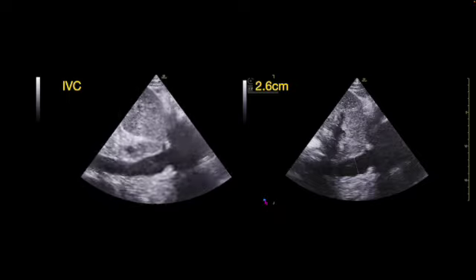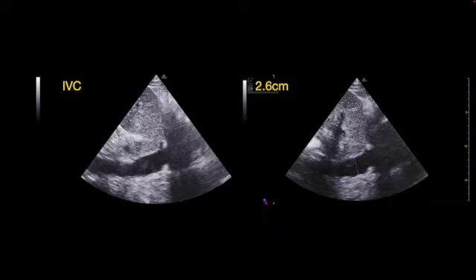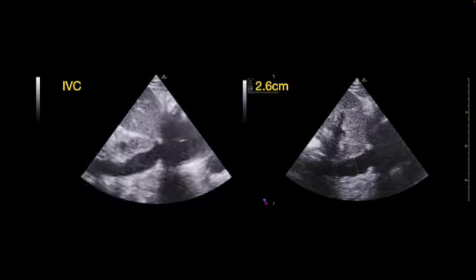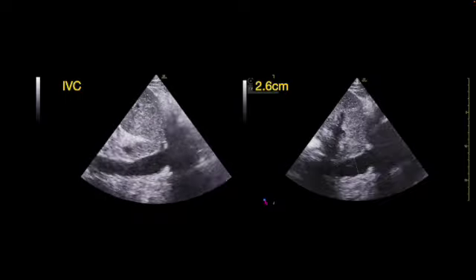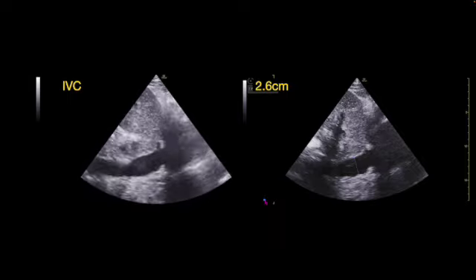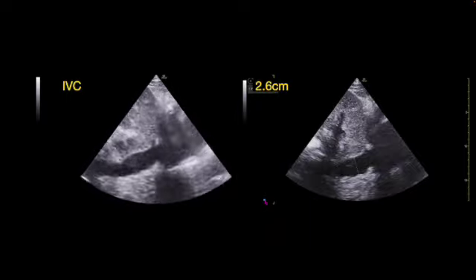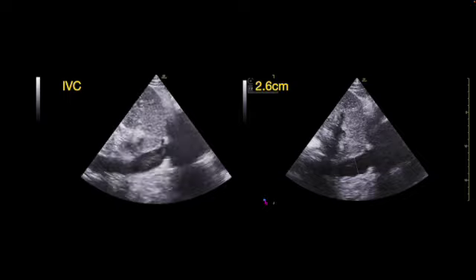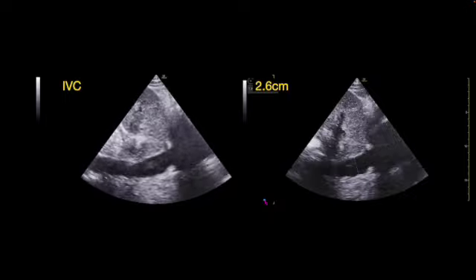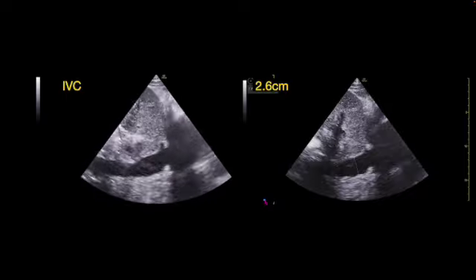The IVC is great. It is kind of controversial, looking at the IVC solely for purposes of answering some questions. So that's why you always incorporate the IVC into other examinations: heart, lungs, IVC, and other images if you need them. Don't use it solo. It should be incorporated into a more global assessment of your patient with point of care ultrasound. And another thing is the IVC has great sensitivity when it is really small or really big. In the middle, it's just not very helpful.